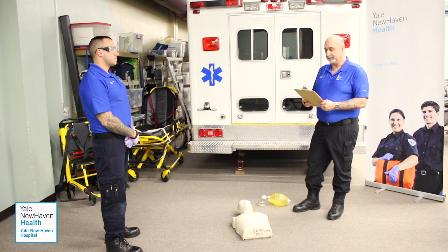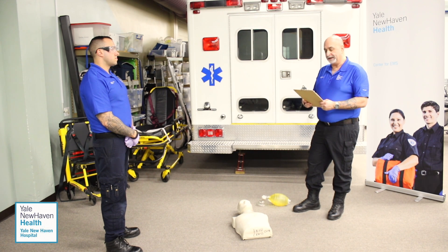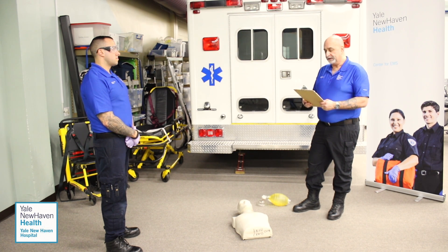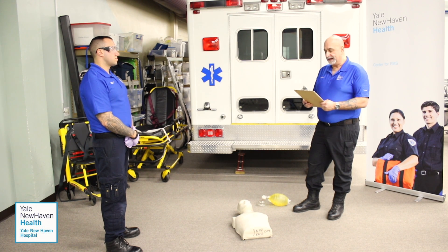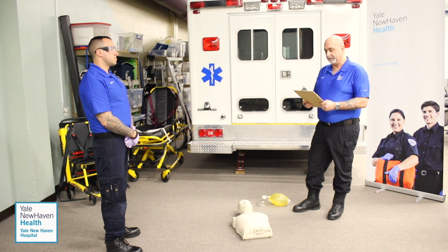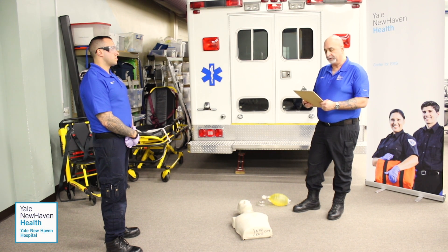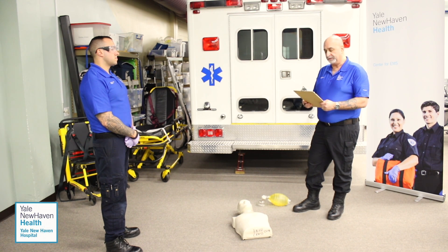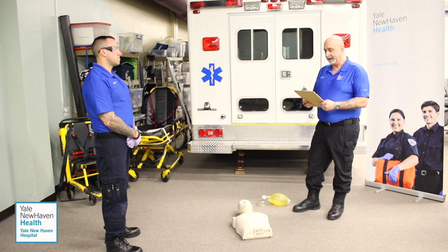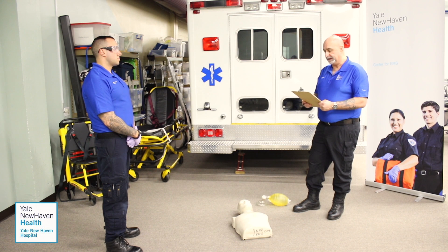You must physically perform one-rescuer CPR and operate an AED including delivery of any shock. The patient's response is not meant to give any indication whatsoever as to your performance in the skill. Please take a few moments to familiarize yourself with the equipment before we begin, and I would be happy to explain any of the specific operational features of this AED.